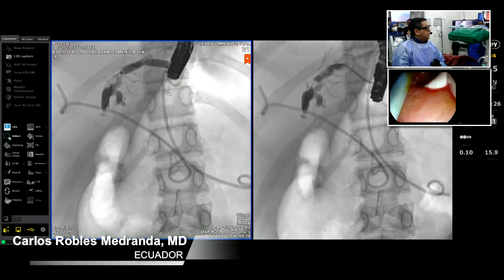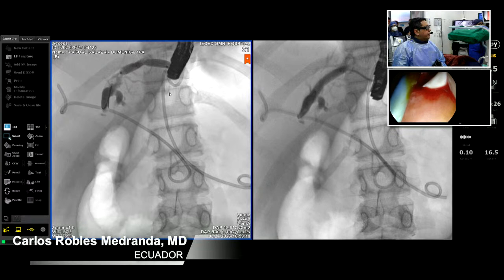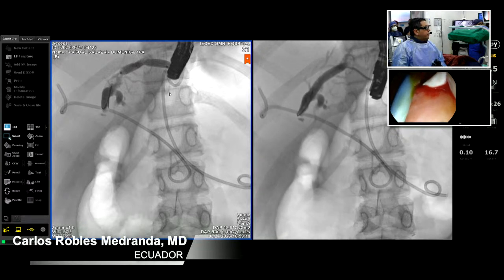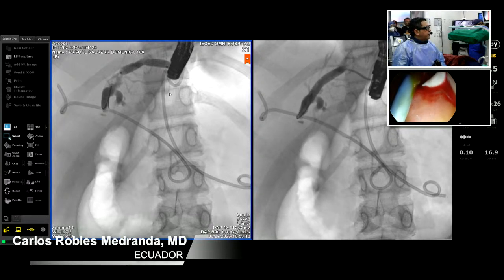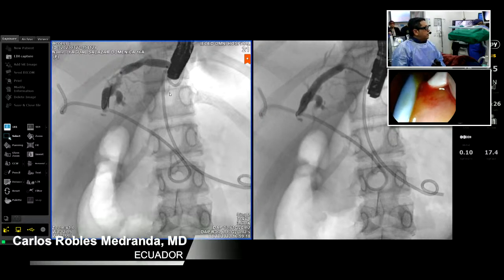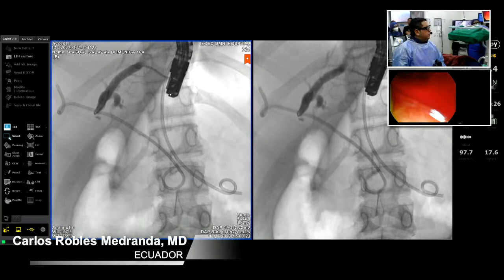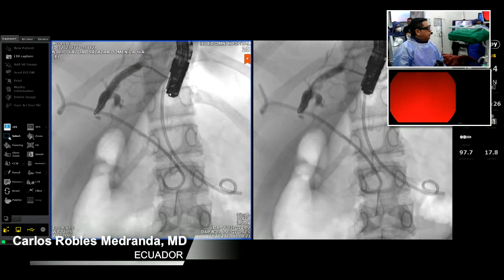And I see there is a communication. Okay, perfect. Okay. So deflate. One moment.